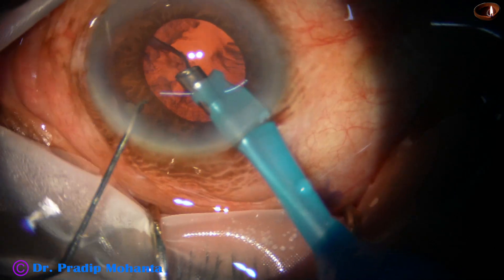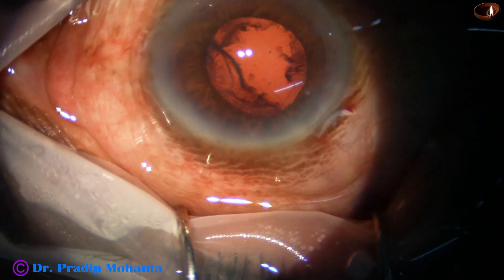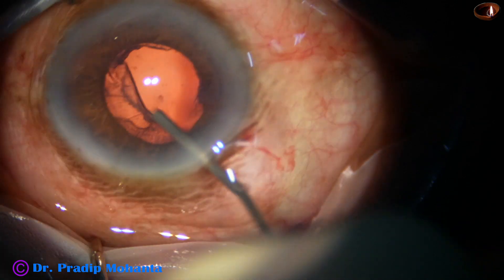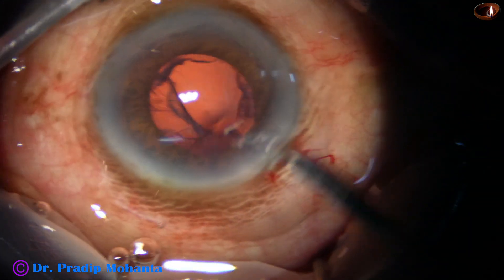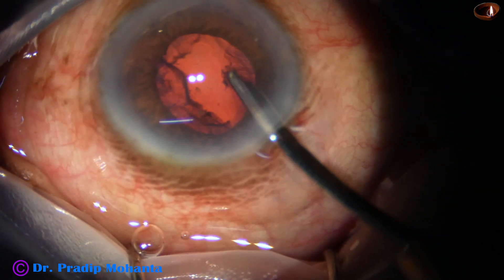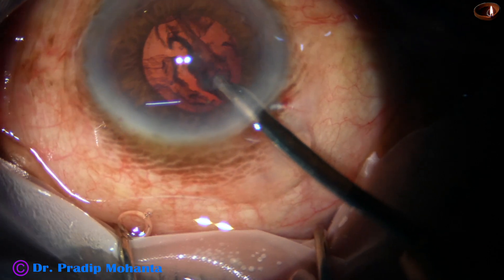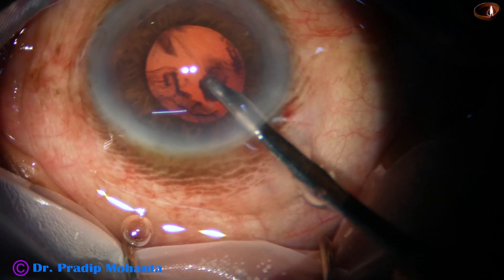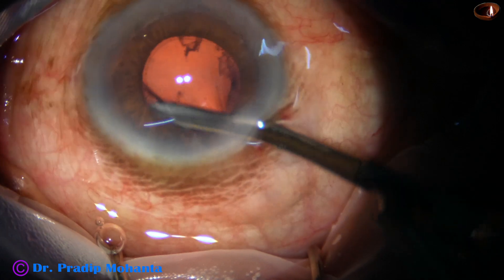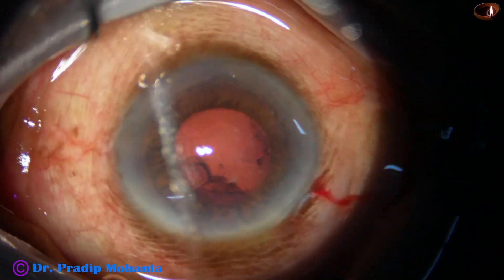I am using stereo coaxial illumination at this time. It gives more depth and the position of the posterior capsule can be made out better with stereo coaxial illumination. And now is the time to clean the cortex. I am using a Simcoe cannula because I can control this instrument much better than bimanual irrigation aspiration. Automated instruments are on the higher side of risk in complicated cases, but with this instrument the vacuum is in my hand, not in my foot, so I can control it better.